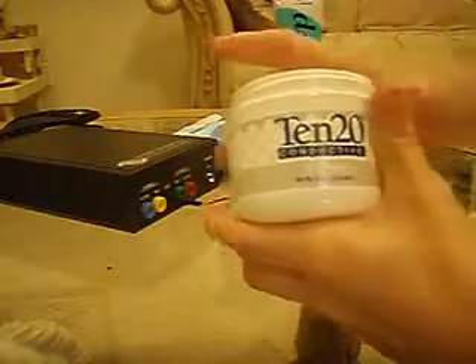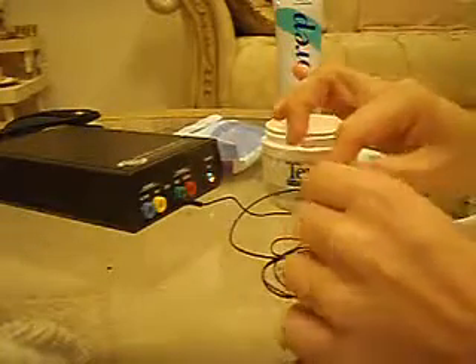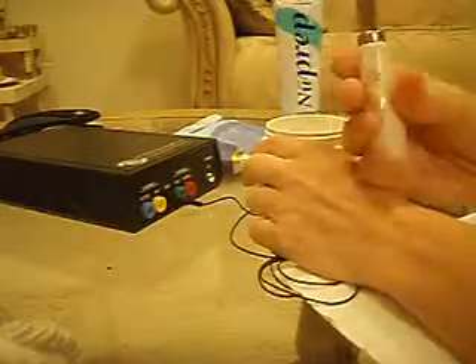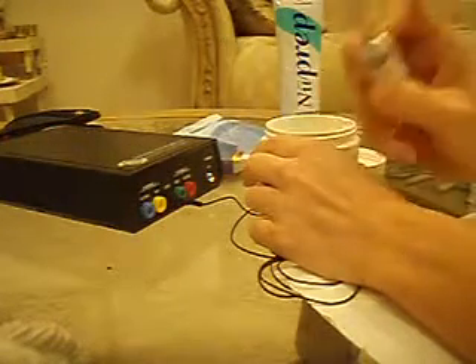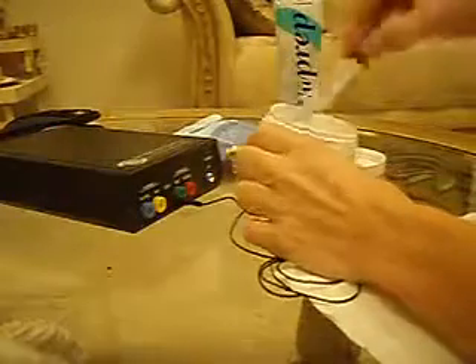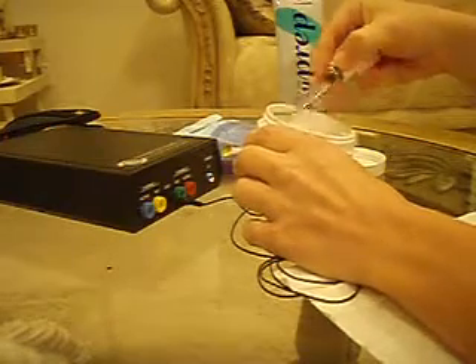You're going to use 10-20 conductive paste. You can use a craft stick or wooden popsicle stick to get the paste onto the electrode. You can also use just a small cheese dip spreader type of knife. These are actually a lot easier to use because they clean very easily — you can use alcohol pads, soap and water, or a dishwasher. Whereas the popsicle sticks cause a lot of waste and aren't really reusable.